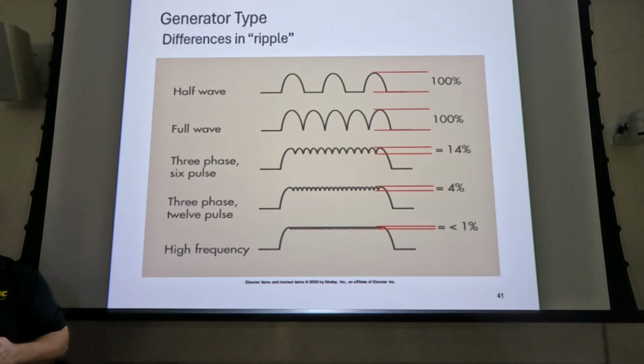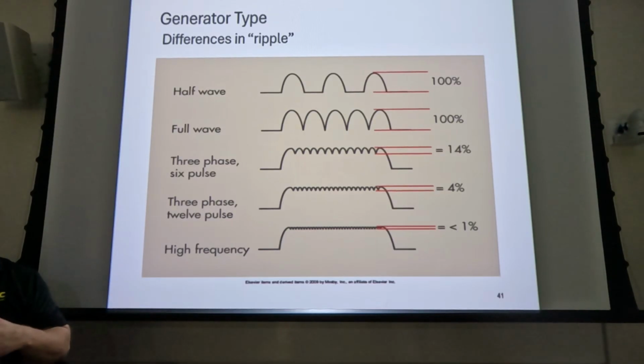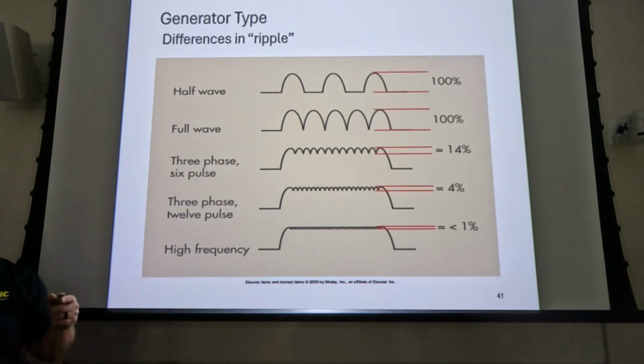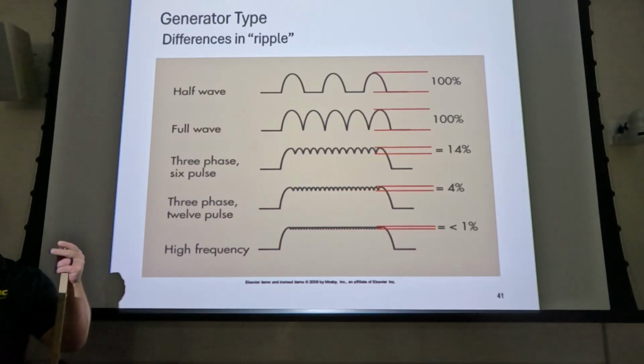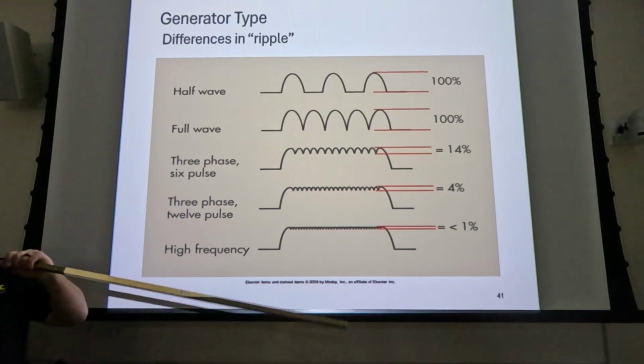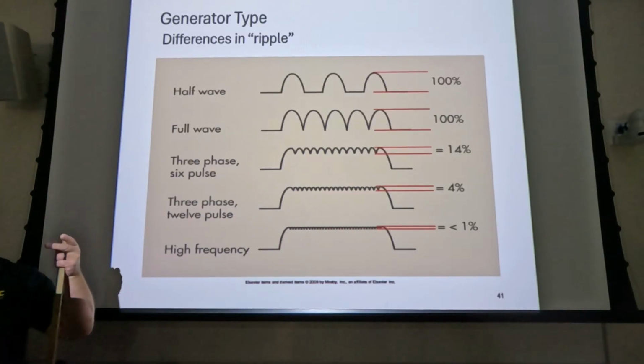Now, you're going to have a tendency to kind of conflate filtration and machine phase, okay, because they have some of the same characteristics. With filtration, our minimum changes, right, but the maximum does not change, and the average goes towards a high energy side. But what happens with the numbers? We increase filtration, numbers go down, right? With machine phase, it shifts towards a high energy side. Peak energy does not change, but the numbers go up, okay?